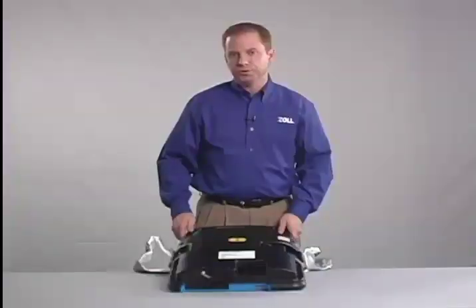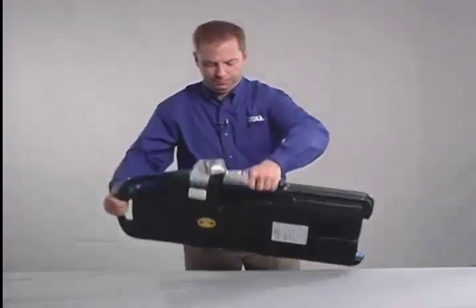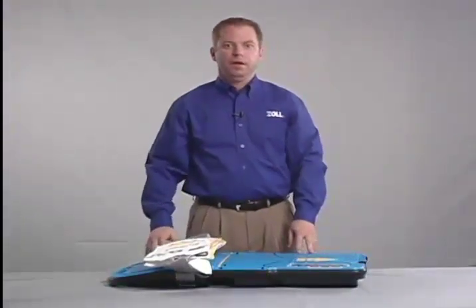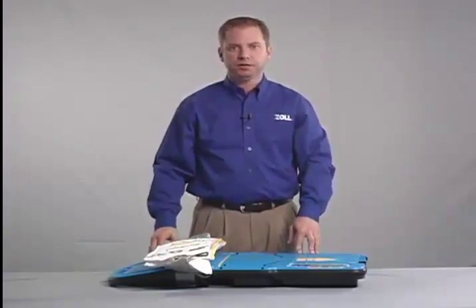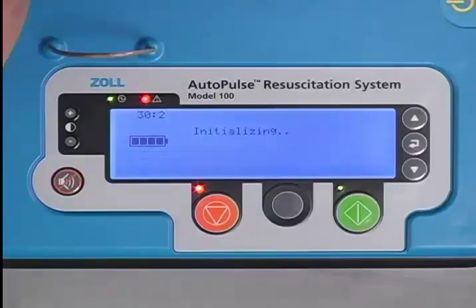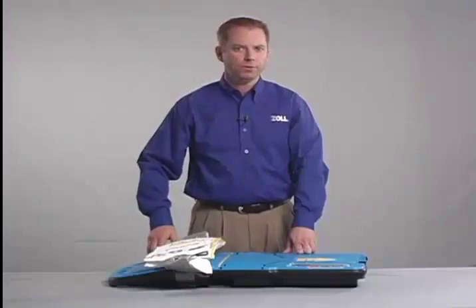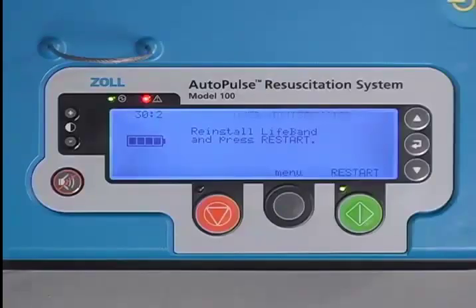Turn the Autopulse over and power it on. Every time you power on the Autopulse, it runs a complete system check. If the lifeband is installed properly, you will see the startup screen without any user advisory message. However, if the Autopulse detects the lifeband is not installed properly, the red alert LED will be lit and you will see user advisory number 12 on the user display.